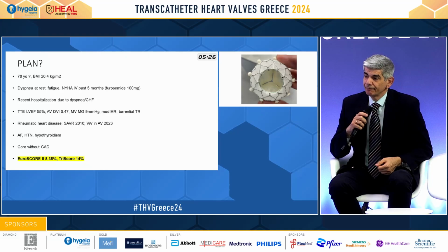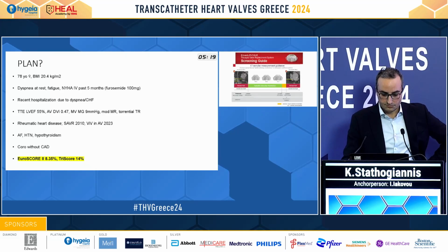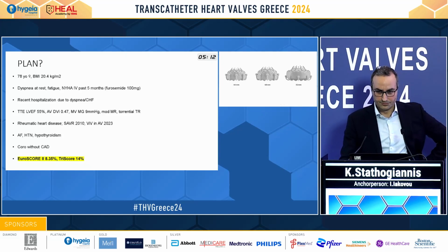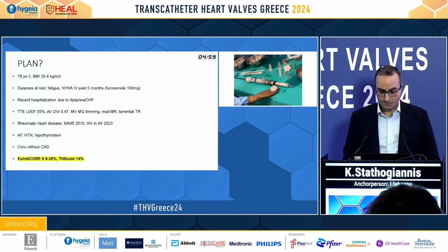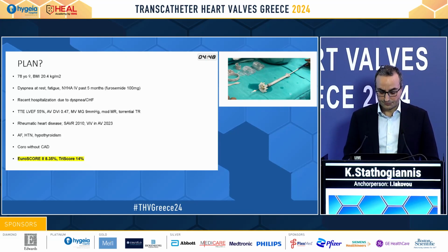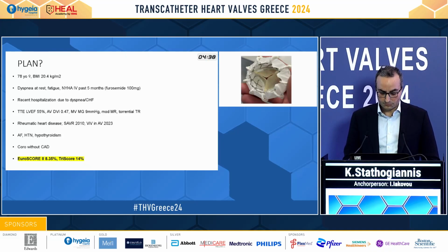If I can make a comment here, this patient initially, it was thought that the aortic valve degeneration, the bioprosthetic degeneration, was the problem with the patient. And despite the very low velocities there, 2.5, 2.6, it was decided in another center that TAVI should be done, and that would resolve the problems. At that time, the mean gradient of the mitral valve was measured at 4 or 5 millimeters of mercury, and the tricuspid regurgitation was oversighted, despite that it was torrential, with this huge gap. So not strange that TAVI didn't make any change in the symptoms of this lady.